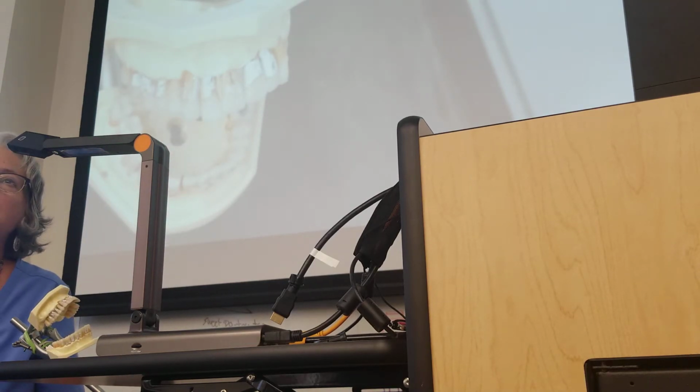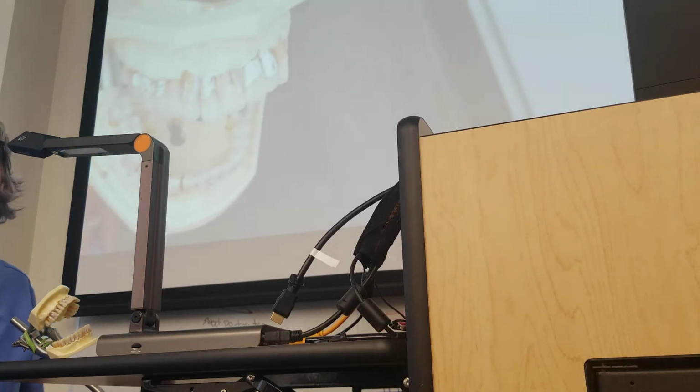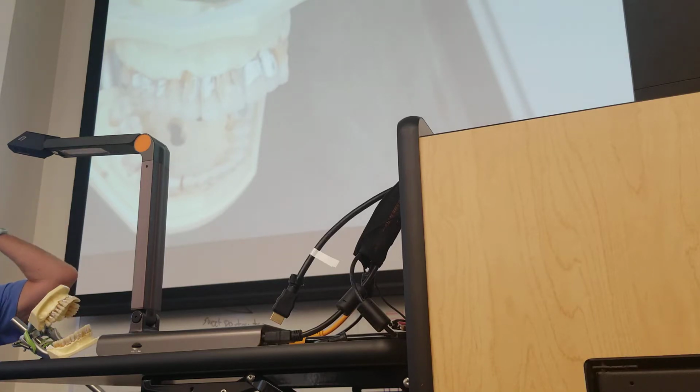Do we start at 0? No, you're not going to start the strokes at 0. You're only going to insert as close to 0 as you can. Then you're going to open it up and begin your working stroke. Because if you use your strokes at 0, you're just going to burnish. And of course, that's not what we want to do.